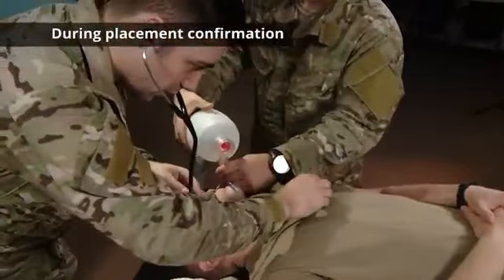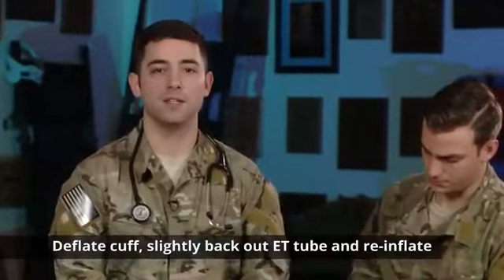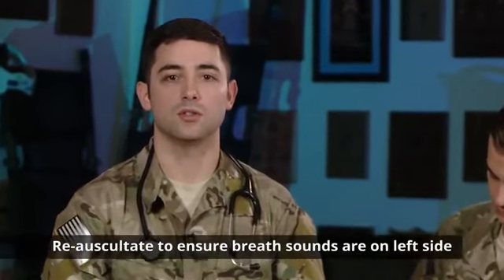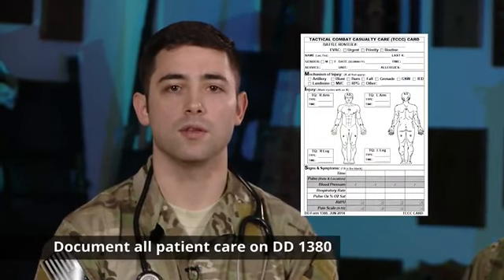During tube placement confirmation, if you have no breath sounds on the left side but positive on the right, simply deflate the cuff, back up the ET tube, and reinflate. Then re-auscultate to ensure that you have positive breath sounds on the left side. Make sure you always reassess your patient, monitor their SpO2 and their waveform capnography, and document all care on a DD form 1380.